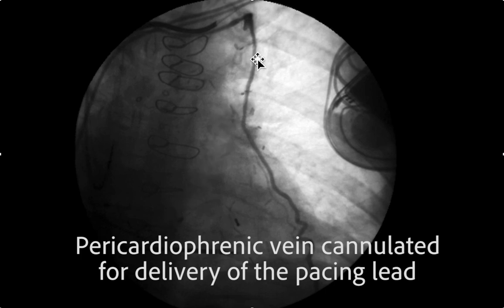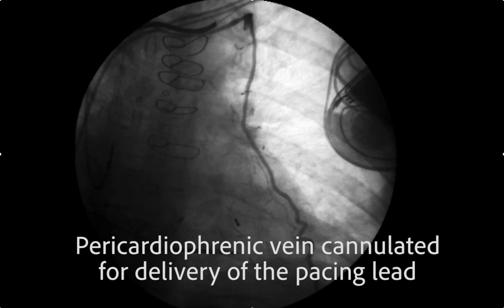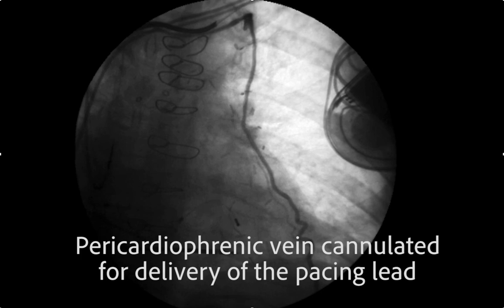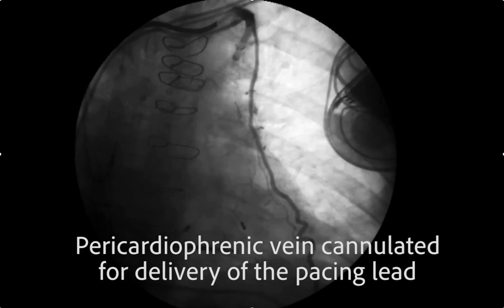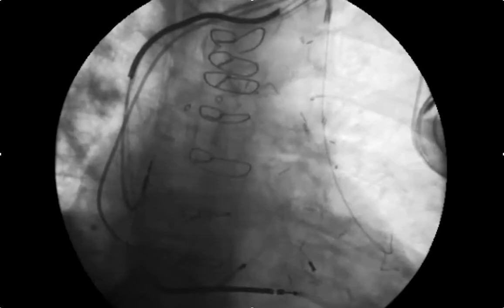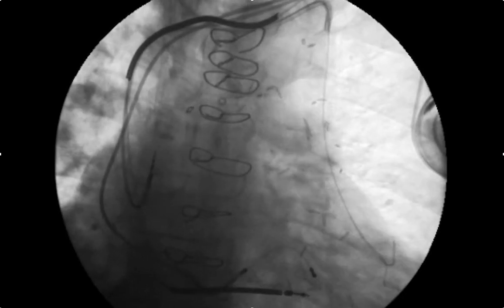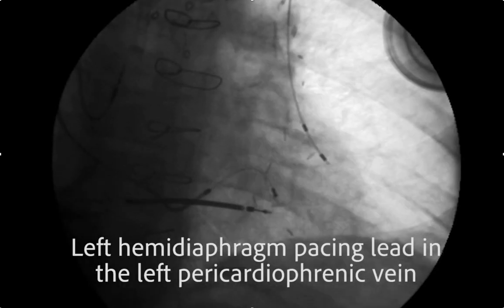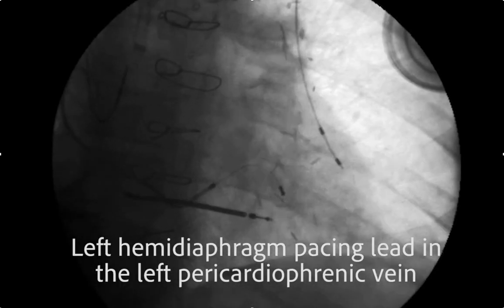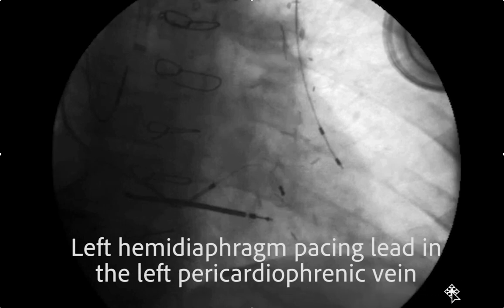This is an actual implant. You can see we've cannulated the pericardiophrenic vein for delivery of the pacing lead using a vein selector and a subselector. Here we have the subselector in the vein and, with a couple of wires down, we deliver the pacing lead to pace the left hemidiaphragm.